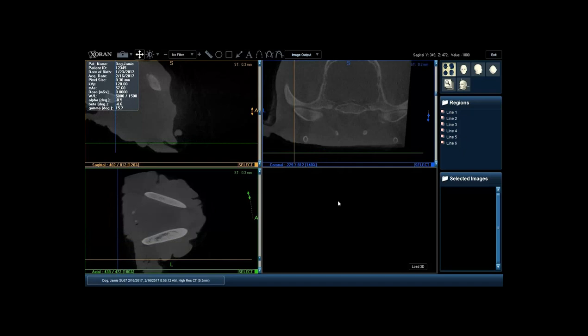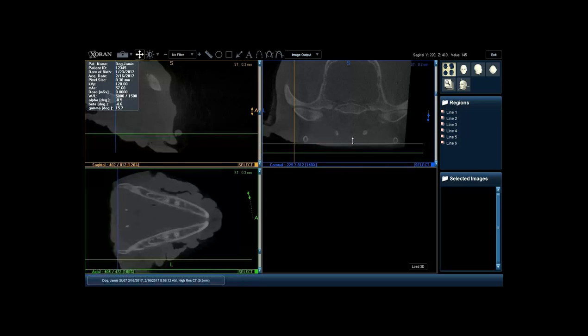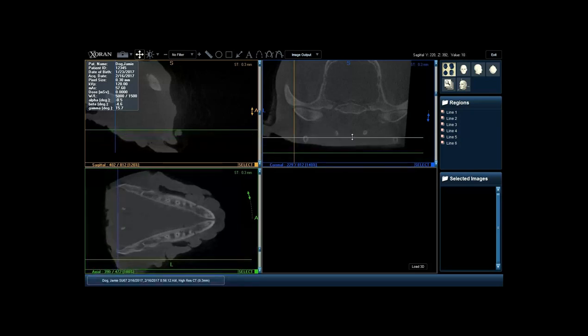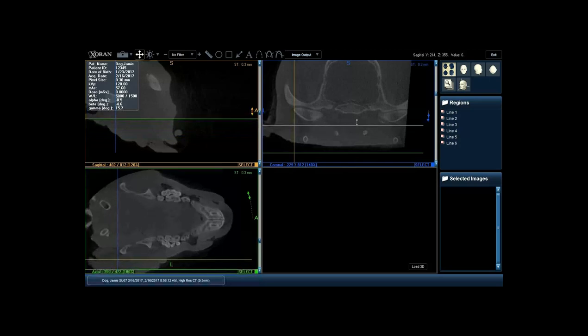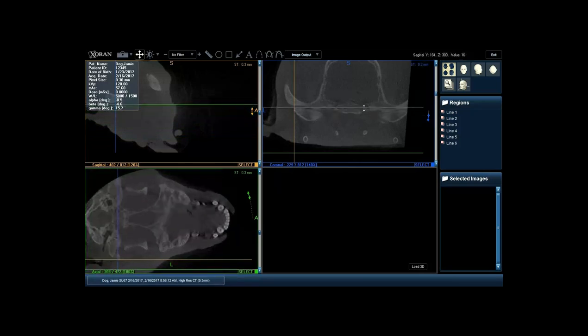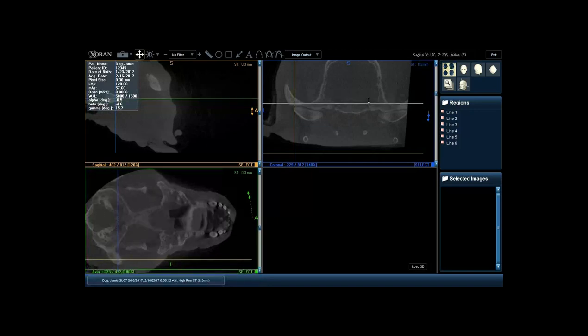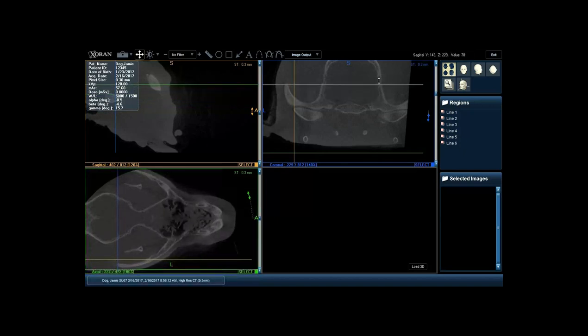We also take a look at everything in the axial view - starting at the bottom and scrolling through. We looked at that abnormal bone growth, and then we look at everything else: identifying location of the teeth, bone loss, whether or not we have any fractures. For those trauma cases coming to you, you can very easily look at these images and identify those caudal maxillary or caudal mandibular fractures that you're not necessarily going to be able to see on your intraoral radiograph.